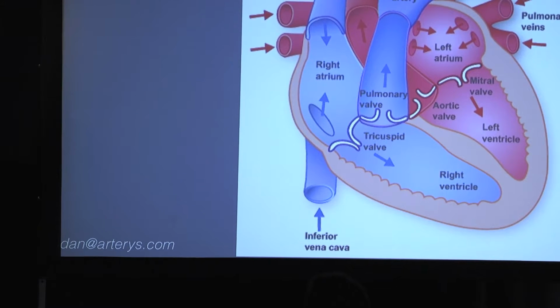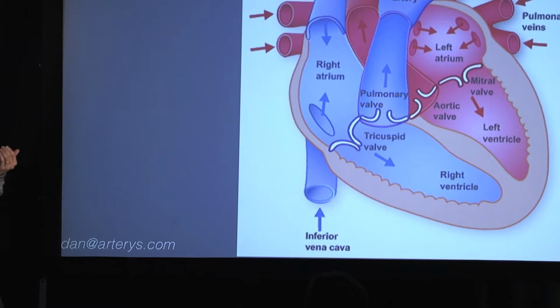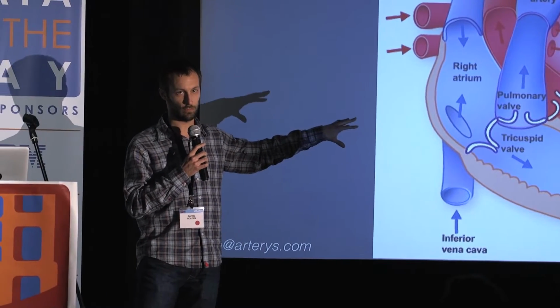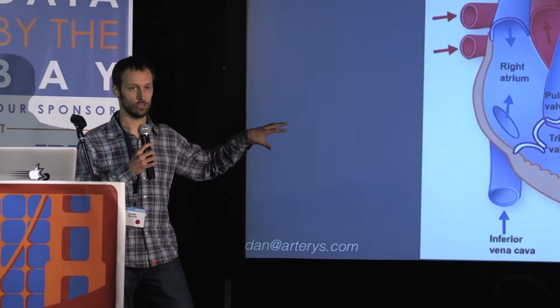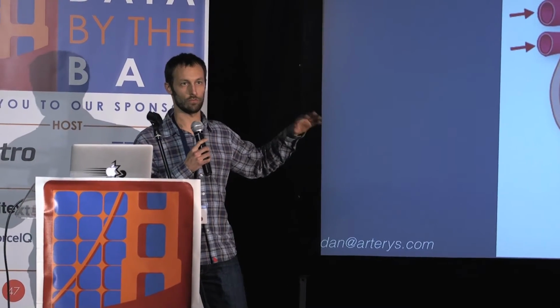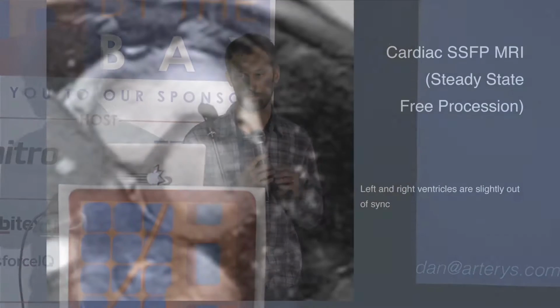So in a lot of different types of cardiac disease and dysfunction, the ventricles are the region of the heart that are affected, the pumping regions. So these are a particularly important area for performing segmentation on and for quantifying the volumes.